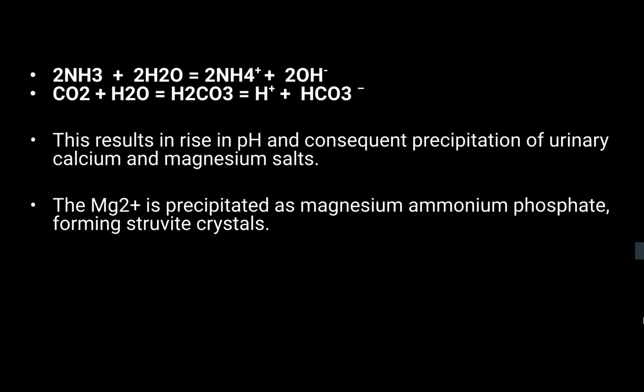During the procedure, I'll try to do the procedure quickly. I'll not be opting for mini PCNL in this case. This is definitely a case for standard PCNL. I'll be using an Amplatz dilator, and I'll be using a pneumatic lithoclast or a laser to break the stones down into pieces, which I'll be extracting as quickly as possible. I'll use low pressure irrigation to make sure that there is no increased intrapelvic pressure during the procedure. Okay, we'll stop there.